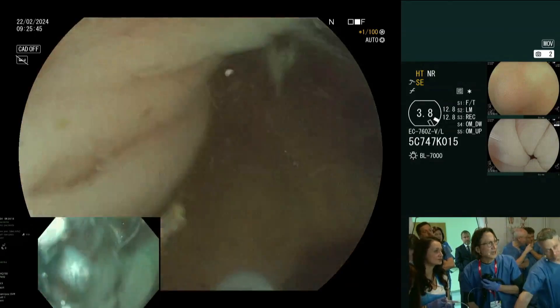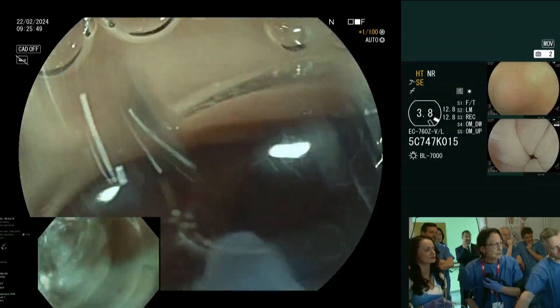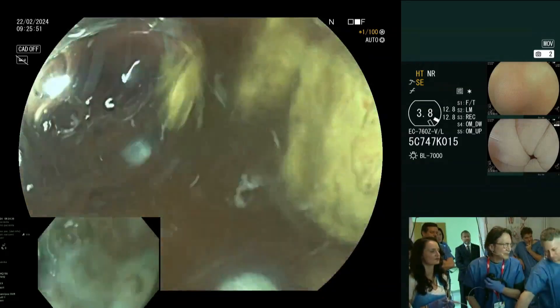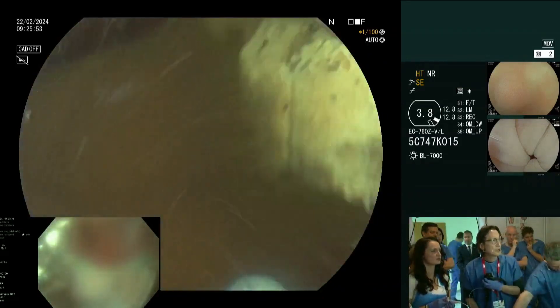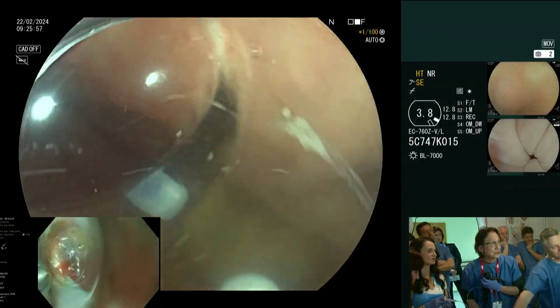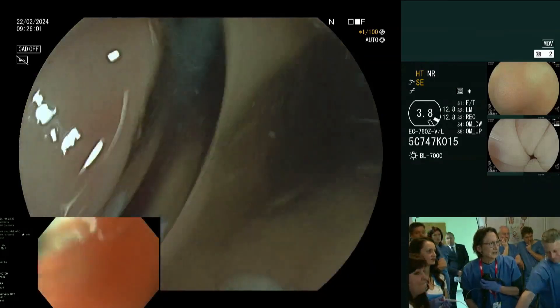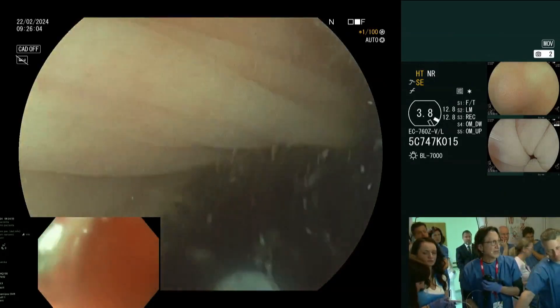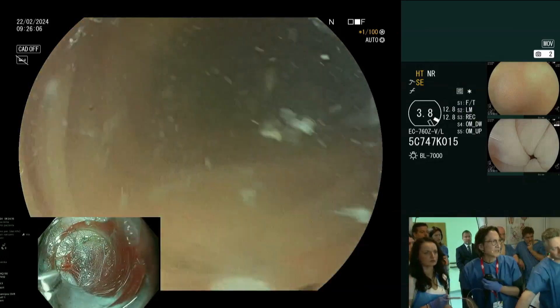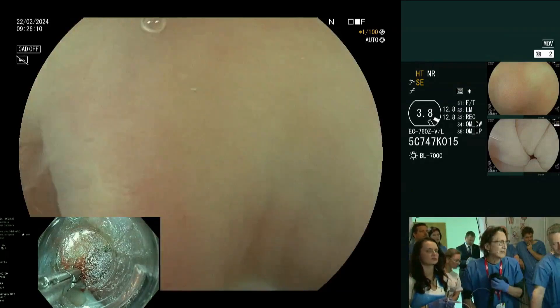It is a little contaminated here as well, and we're not getting gas in. Is the water bottle still full? You can see this patient had very severe diverticulosis, which is why you see the fecal debris here — this is partly why it was so contaminated. I think I fell back a little bit, so let me go back in again.